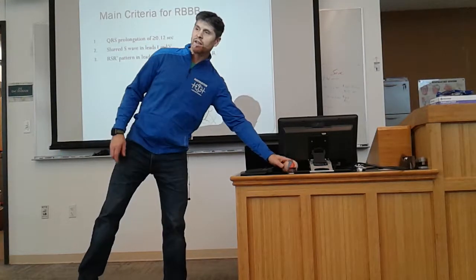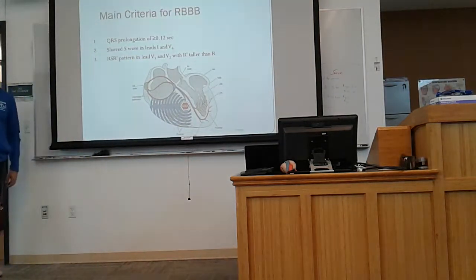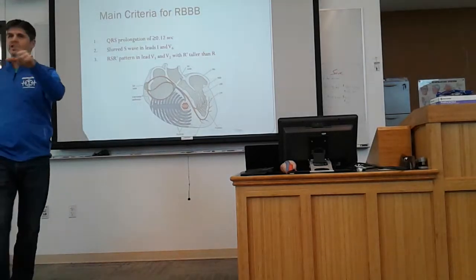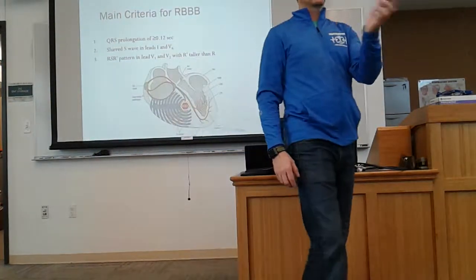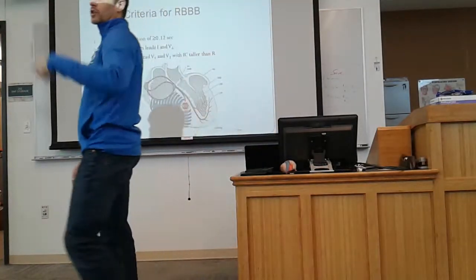I'll give you several examples of what that might look like. Okay? I have a supraventricular rhythm. My QRS complex is wide. I'm looking in lead 2 because I'm just watching dynamically as it goes by. I just put the leads on my patient. I notice that I've got a sinus rhythm on the monitor, but I look at my QRS and I go, it's wide.